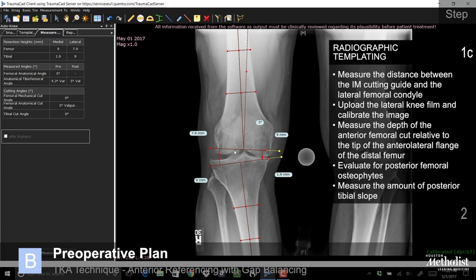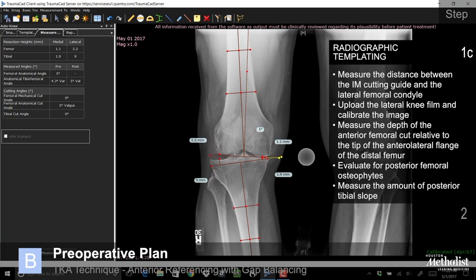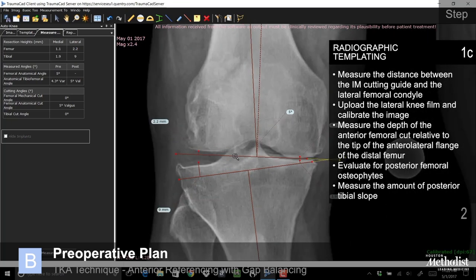Having a templated image also provides a visual reference to compare to the resected bone. Measure the distance between the IM cutting guide and the lateral femoral condyle. While most surgeons prefer a 5-degree distal femoral cut, I routinely use a 3-degree distal femoral cut to provide improved lateral soft tissue stability.